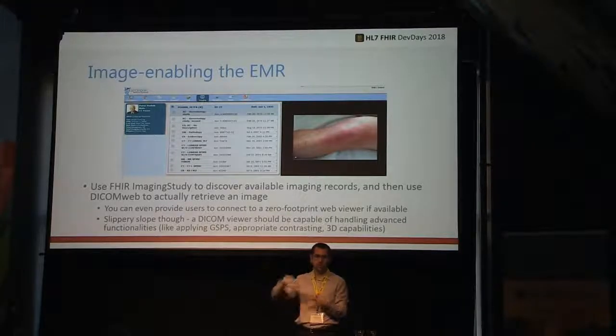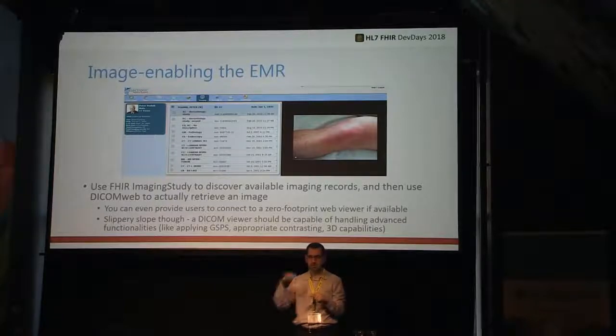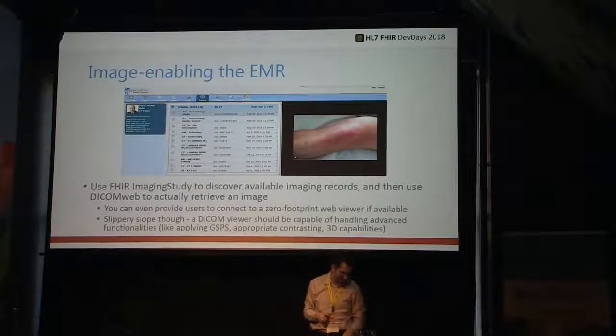But then you can actually interact with the image. You can make measurements. You could change, for simplicity, I call it brightness and contrast. But in DICOM, you probably would be shot if you called it brightness and contrast. It's called window level and window width. So just keep that in mind. People are very sensitive about these things.